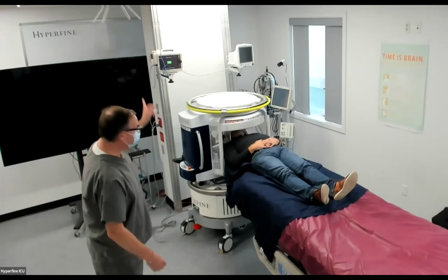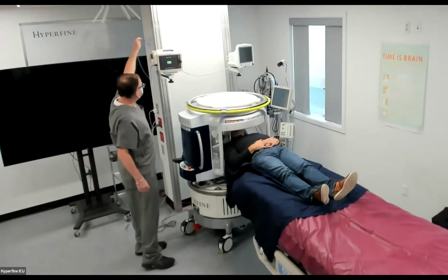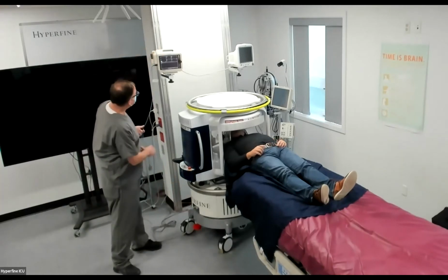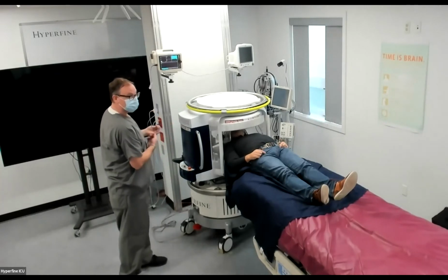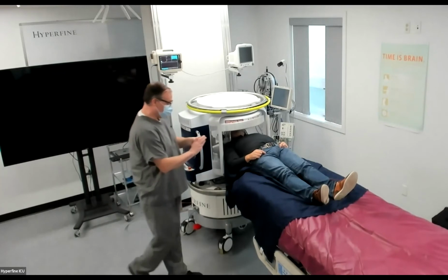And that's it. I'm going to go ahead and hook our volunteer up to a pulse oximeter just from a standard patient monitor. And Khan is able to control the scanner from Chicago across the web page interface.